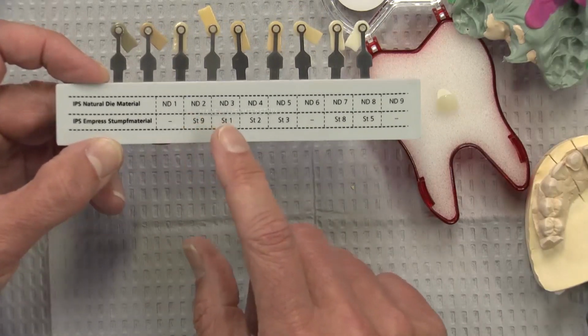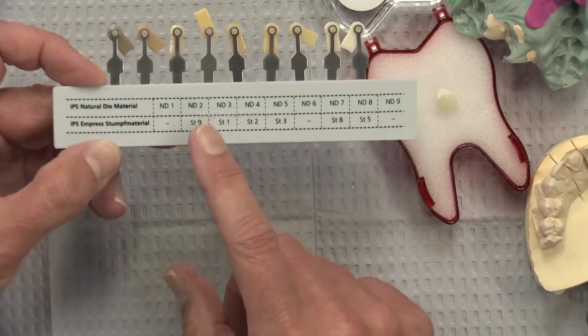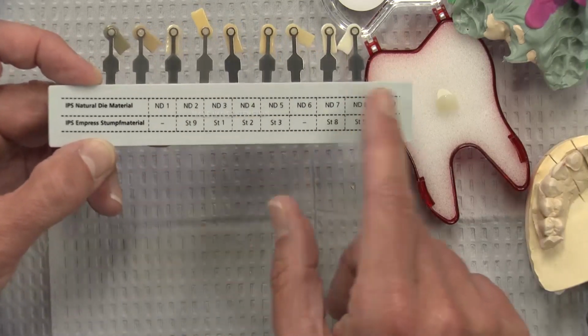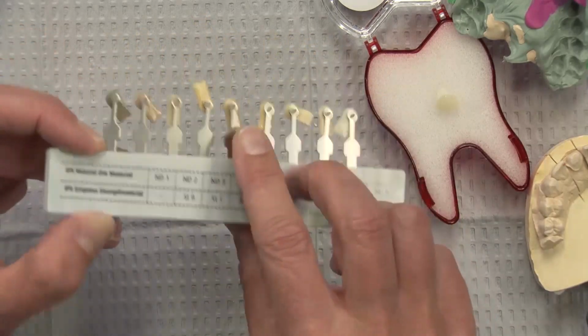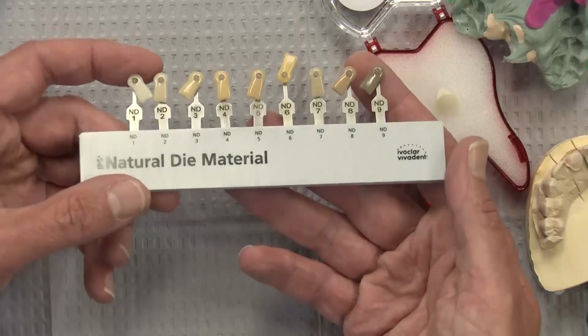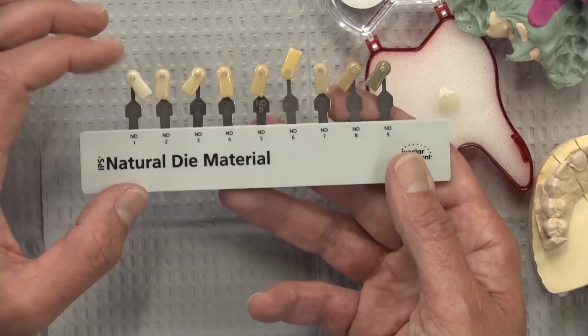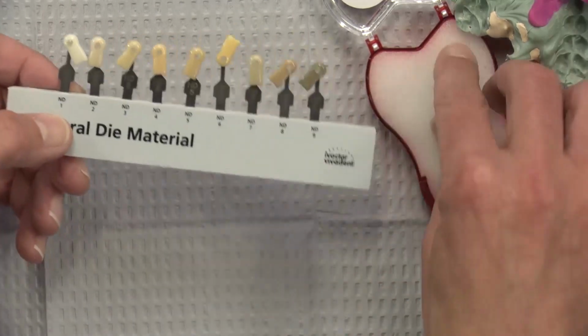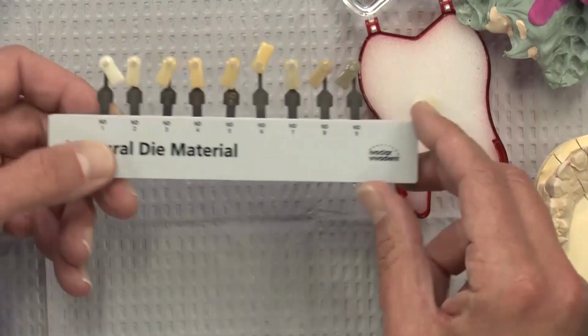You can see how those older ST shade tabs for the Empress stump shade compare to the new Natural Die material, as it's called. This is what we use now. We talk about the ND shades for Natural Die, because they also sell this in die material that we can put on the inside of a crown like this to check it before it goes out.